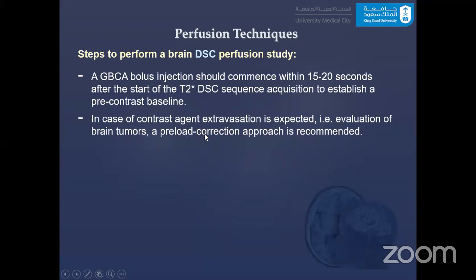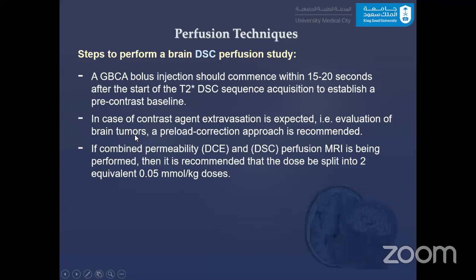So in case of contrast agent extravasation is expected. In the evaluation of brain tumors, the preload correction approach is recommended. We will discuss again preload and the importance of preload.